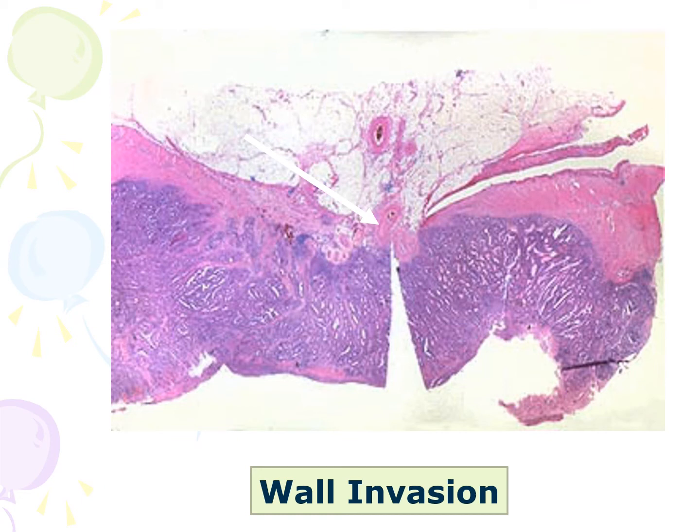This slide shows adenocarcinoma with wall invasion. As you can see, the malignant glands are reaching deep into the colonic wall.